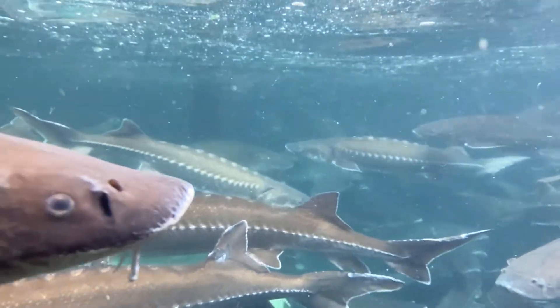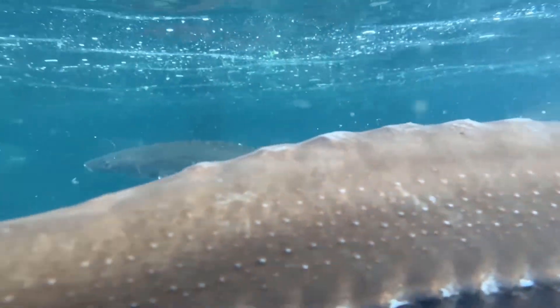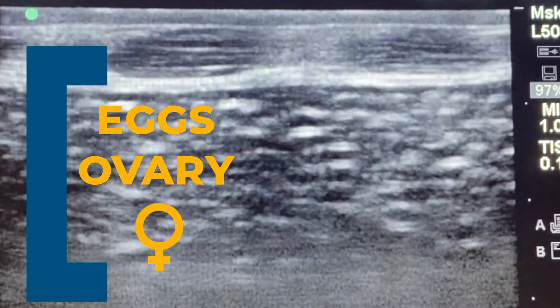Now let's look at that third fish — a big caviar female. Now that's a lot of eggs.